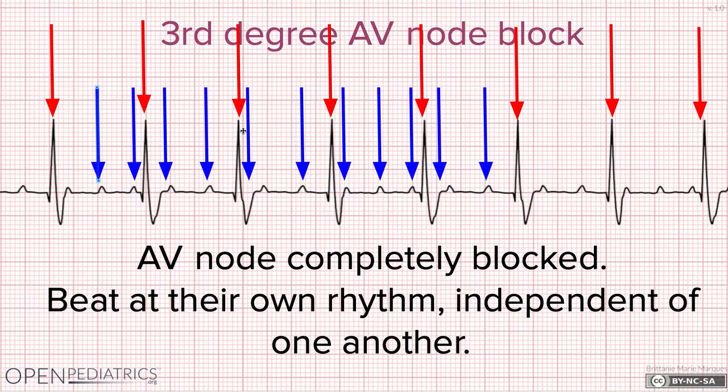So now, if you want to, I've posted a series of 6, 7, or 8 ECGs to practice identifying the ones that we just went through in this video. So before lab, you can go through those ECGs, diagnose them, and bring them to lab. And if they all look good and you can explain them, I will say peace out. Or your instructor will say peace out. But if you can't, I will be there, and your instructor will be there to help you through how to diagnose those ECGs.